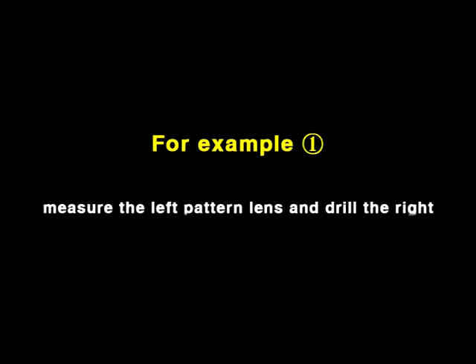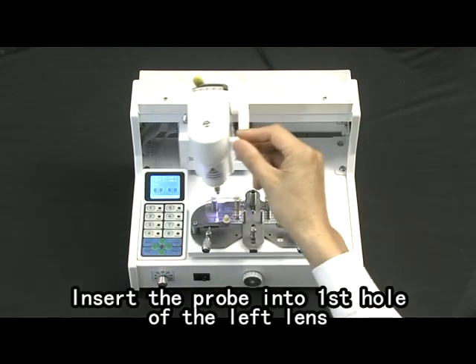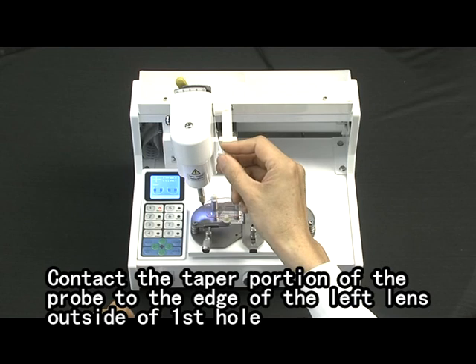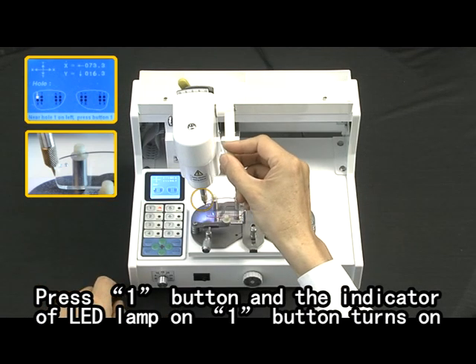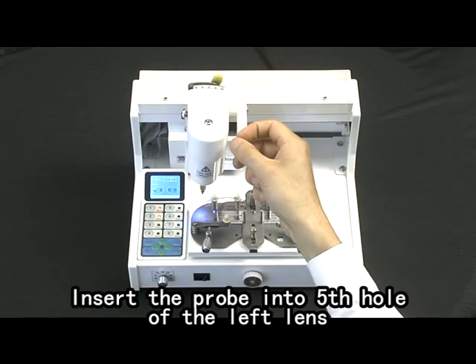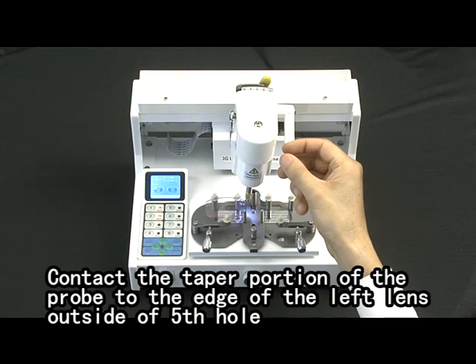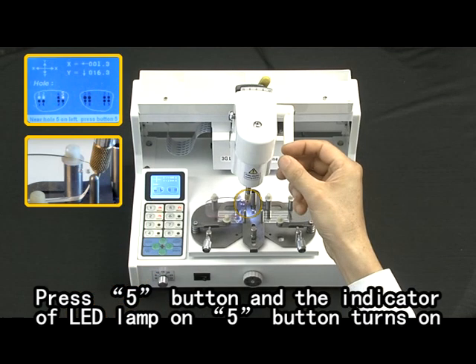Example one: measure left pattern lens and drill the right needed lens. Load the pattern lens. Press the measurement button. Tilt the head to the left. Insert the probe into the first hole of the left lens. Press the left arrow button and the indicator LED on the one button blinks. Contact the taper portion of the probe to the edge of the left lens outside of the first hole. Press the one button and the LED lamp turns on. Insert the probe into the second hole and press the two button. Tilt the head to the right. Insert the probe into the fifth hole of the left lens. Press the left arrow button and the five button blinks. Contact the taper portion of the probe to the edge of the left lens outside of the fifth hole. Press the five button and the LED lamp turns on.